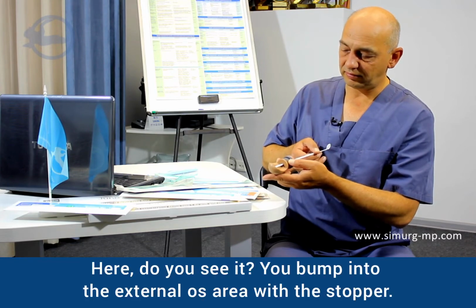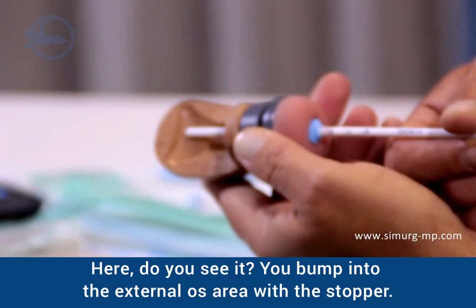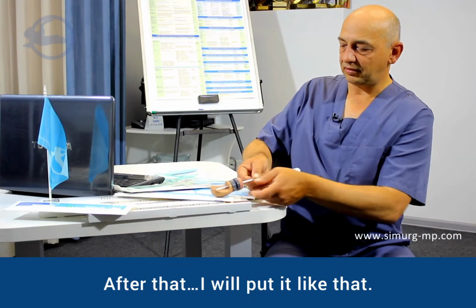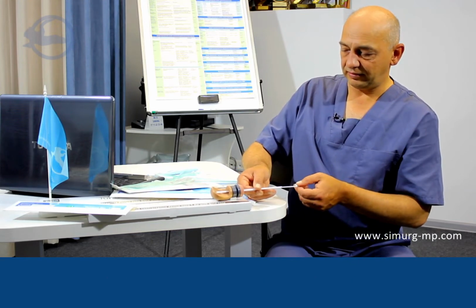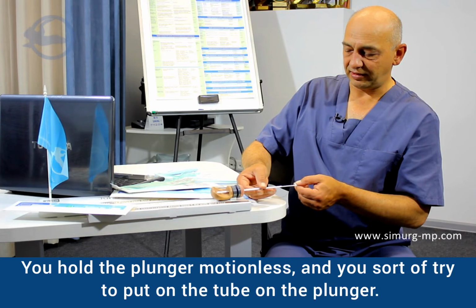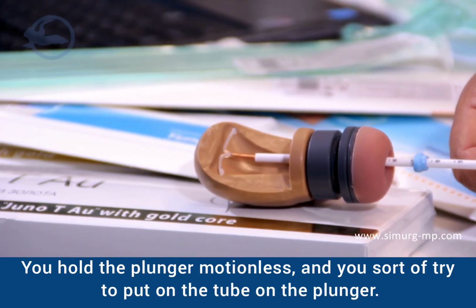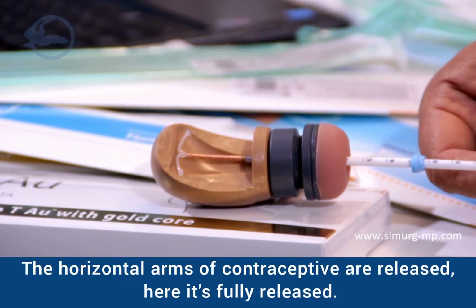Here, do you see it? You bump into the external os area with the stopper. After that, I will put it like that. You hold the plunger motionless and you sort of put the tube on the plunger. The horizontal arms of the contraceptive are released. Here, it's fully released.